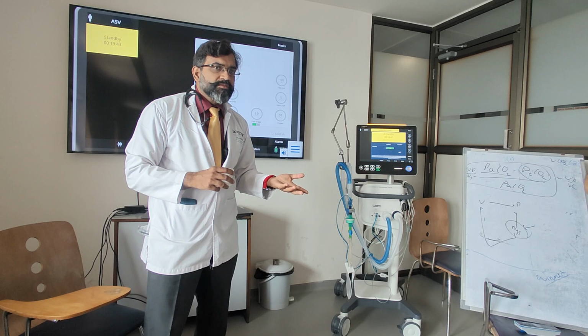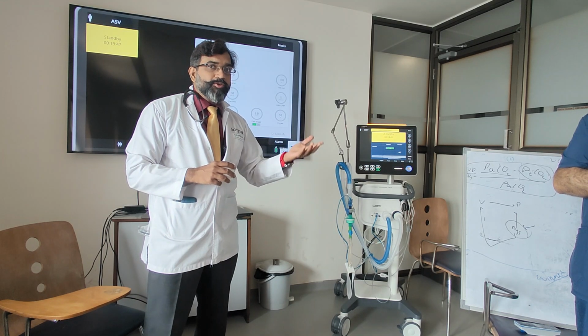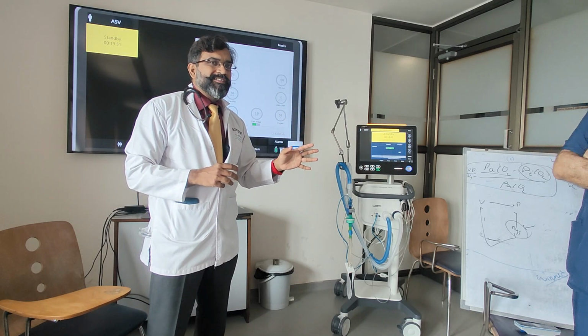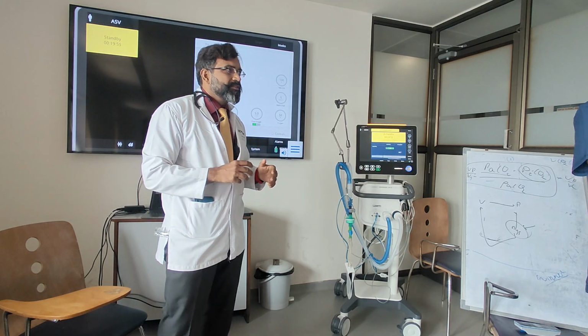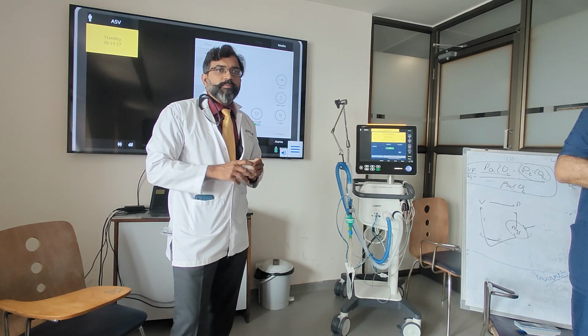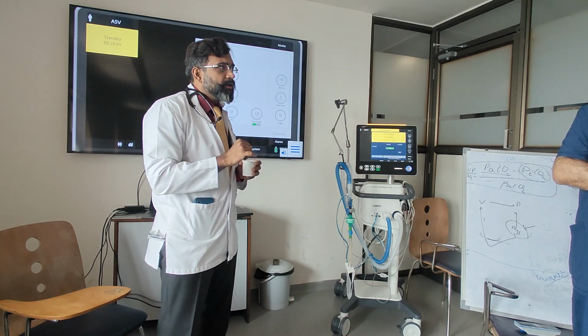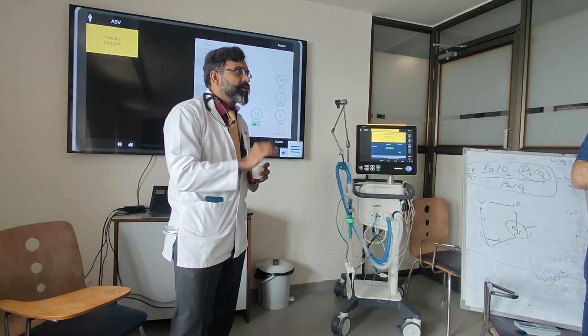ARDS, what do you do? Still high, no? Why low? It's not tidal volume, it's minute volume. It will be higher because you got the point. Yes. So in short, my understanding from this, Akash, is that when the patient is very sick, don't put on ASV. This is my thinking.